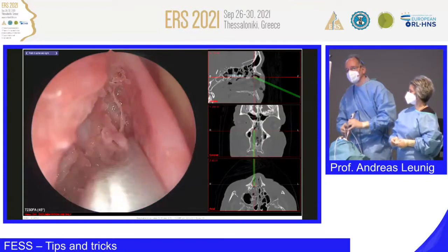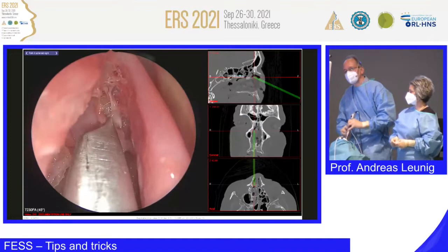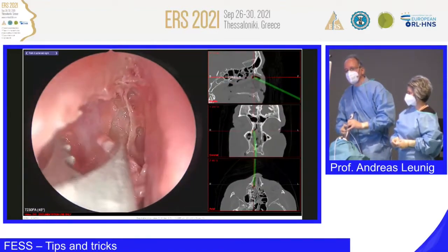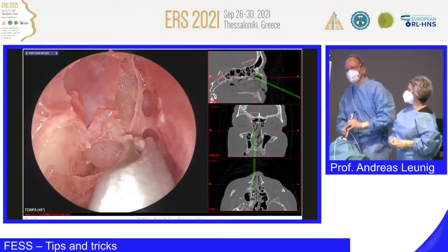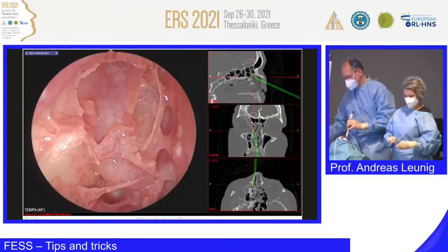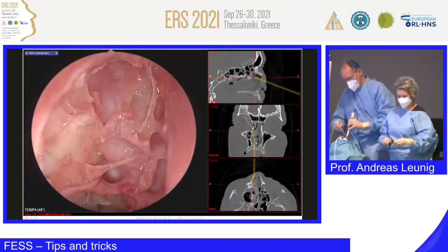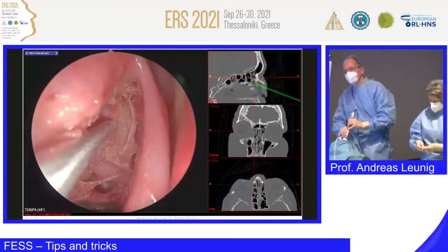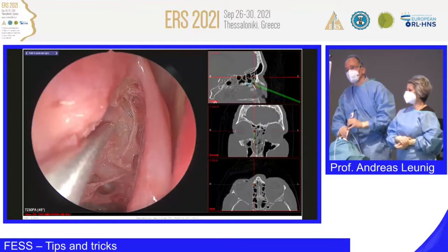And as you can see here, I can remove the mucosa very gently, but I'm not in the frontal. Where's the frontal? I cannot see the frontal. I see some openings, but we'll see. So, now I'm using navigation just to show you. There seems to be something up there.